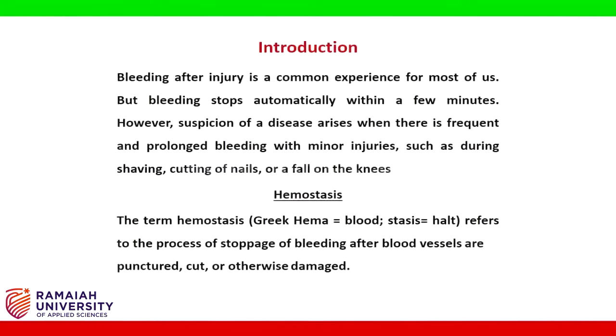Introduction: bleeding after injury is a common experience for most of us, but bleeding stops automatically within a few minutes. However, suspicion of a disease arises when there is frequent and prolonged bleeding with minor injuries such as during shaving, cutting of nails or a fall on the knees.